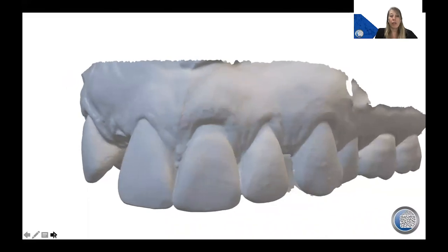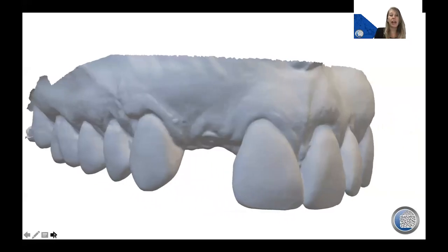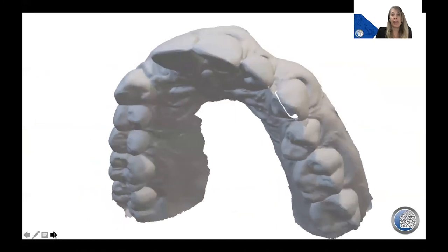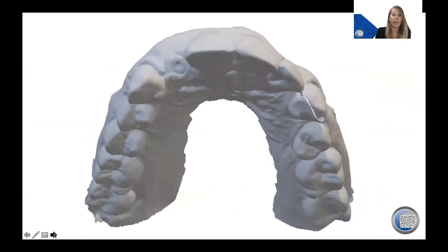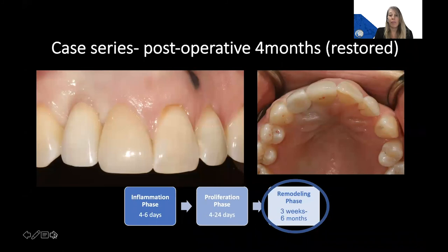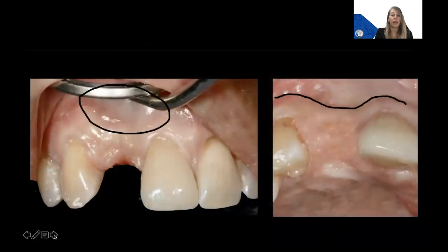An intraoral scan was taken at three months to highlight that volume stability and increase in dimensions, showing in three dimensions the stability and thickness of the augmented site. Compared to the contralateral natural tooth site, the augmentation result is excellent, and I feel very comfortable with these soft tissues after three months. Following placement of the direct fixture crown, there is some blanching of the soft tissues and a slight irritation at the site, which very quickly settles and resolves, with excellent preservation of those tissues maintained throughout.